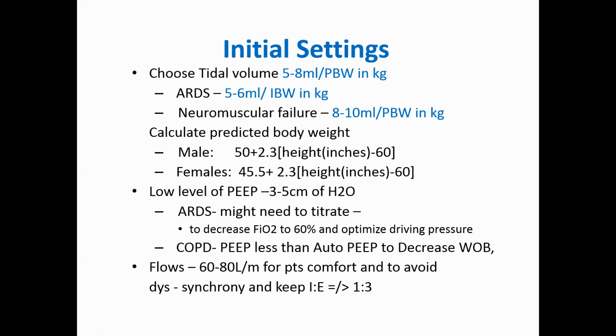That's because you have to look at the 6 cc's in relationship to what the compliance of the lung is doing. So if you're at 6 cc's and your compliance is still very low and you're still in an injurious pattern, you have to decrease the 6 cc's. So 6 is not something that fits all. 6 is a good target, but the target should be what's happening with the lung itself, not necessarily the 6 cc's per kilo. Anyway, we'll talk about this when we talk about the ARDS. And then you calculate it based on the weight of the patient.